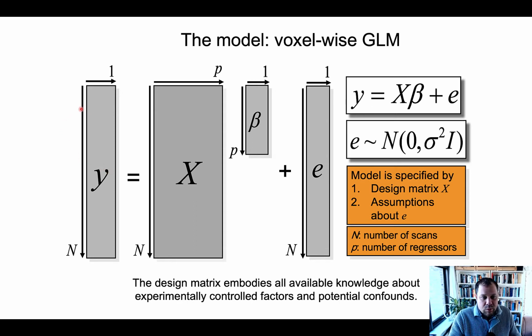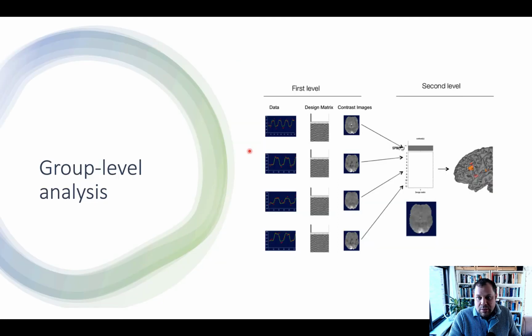So we are doing this general linear model for each voxel, which basically leads to a massively univariate approach, looking at hundreds of thousands of voxels in each participant's brain. From this, we've obtained a map of beta estimates, of beta coefficients, basically. And this then brings us to the final step, to the group level analysis.